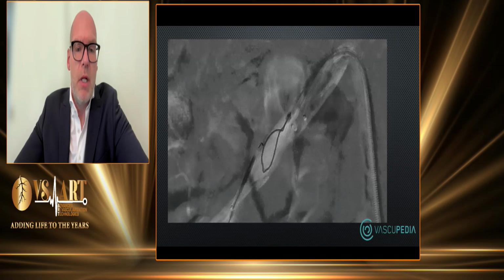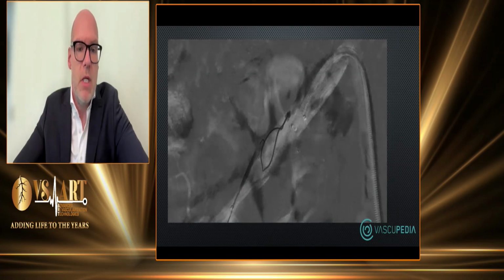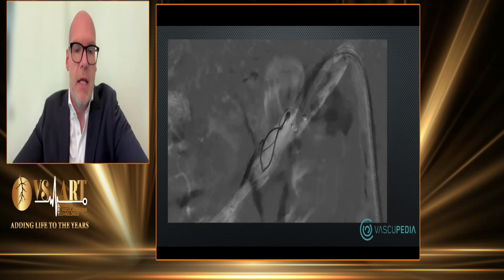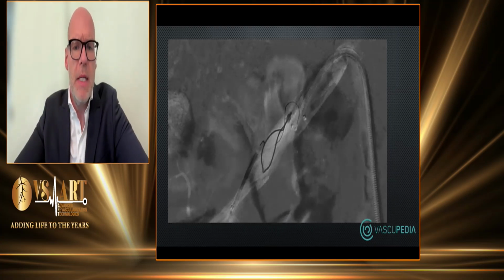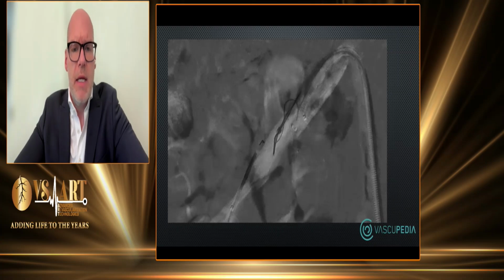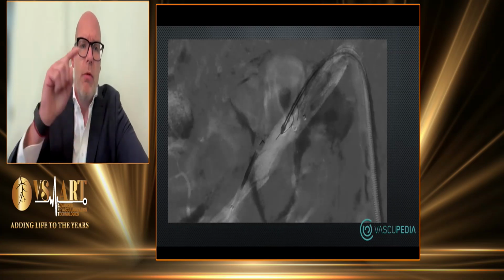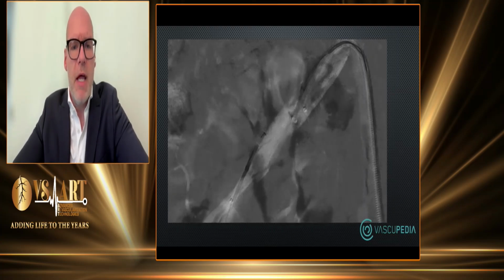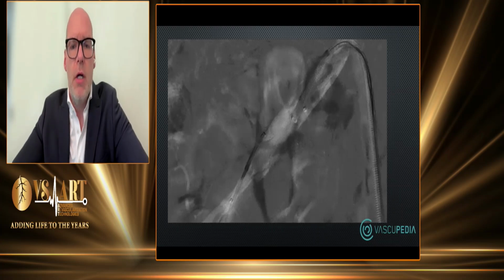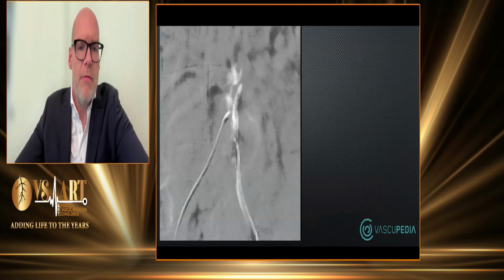This is one example. You see the needle system with a small tip. It's like an L, and then you find the wire, and it goes up and down with a snare. Here you find it in the right lumen, and then we go further through the bifurcation, and we have an up and down wire for the next step to go further to treat the lesion. This is one in the bifurcation.